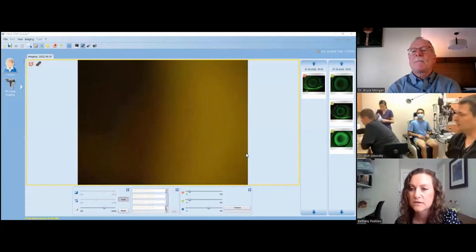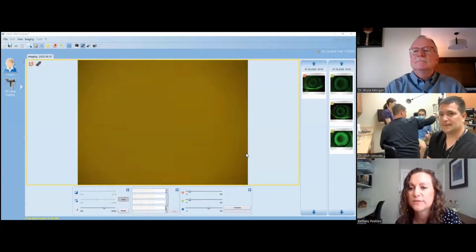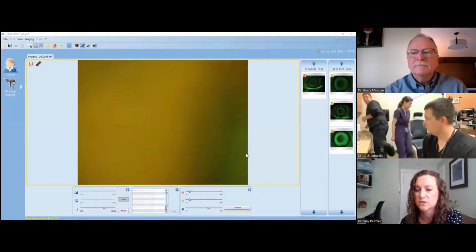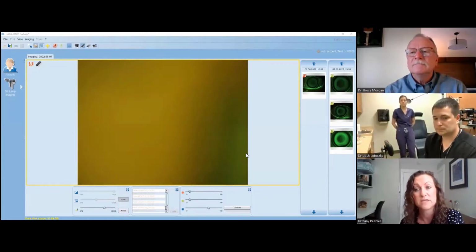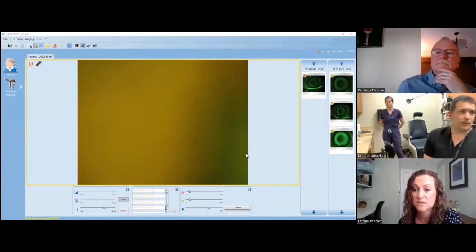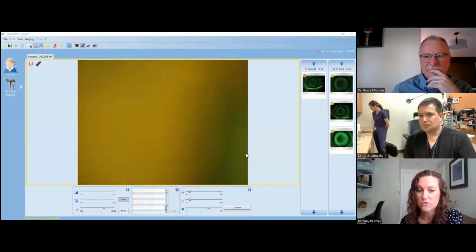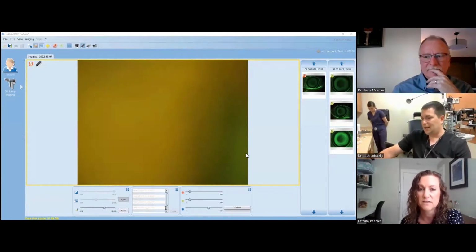While we're doing that, Chad, I just want to hop on for a minute. I know we said we were going to do questions towards the end, which we definitely will, and we've got some great questions. While you're doing this transition though, one of the attendees was a little bit concerned about the lenses because they were sitting a little bit low, and the left eye seemed to be sitting a little bit lower than the right eye. If you guys could just go over that one more time, because I'm in complete agreement with you, I would definitely be dispensing that lens.